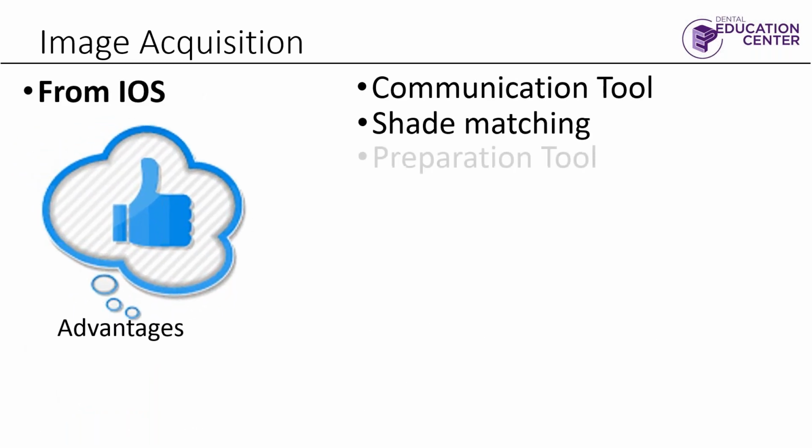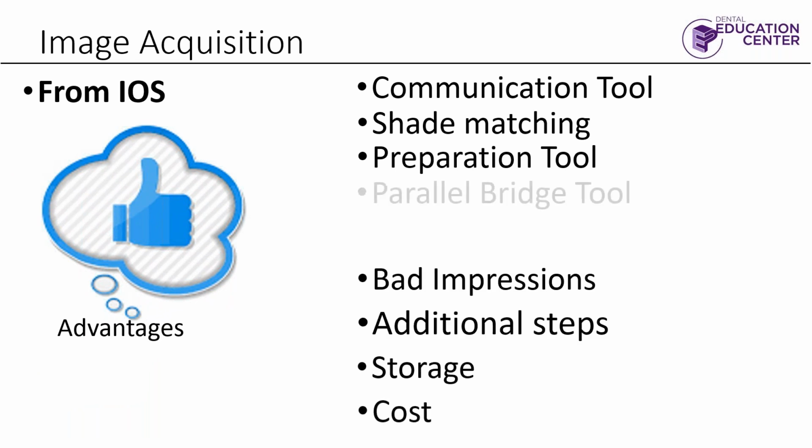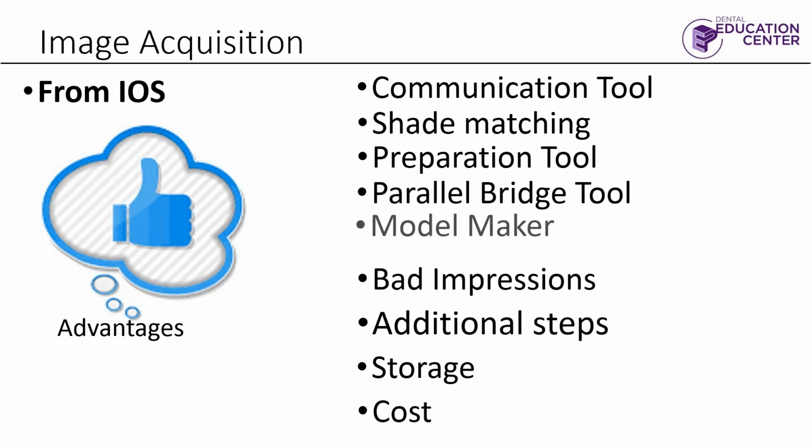It's a great communication tool. Well, and just the decreased chair time too from your delivery visits. I was talking with a doc not too long ago. He's setting aside 60-minute blocks for a single unit crown delivery. With the way that I'm doing mine, a single unit crown delivery shouldn't take more than about 10 minutes. Right.